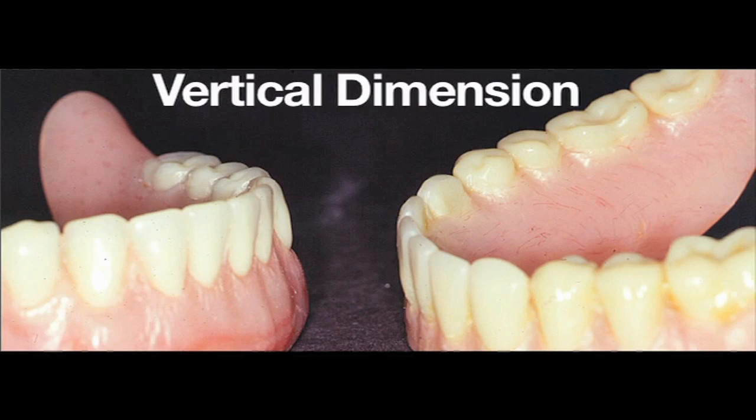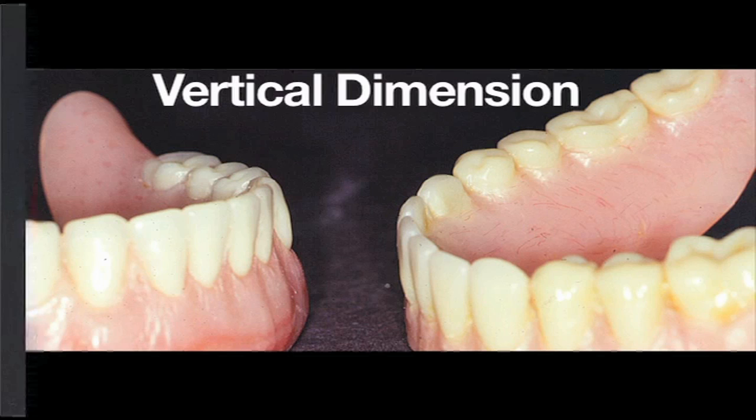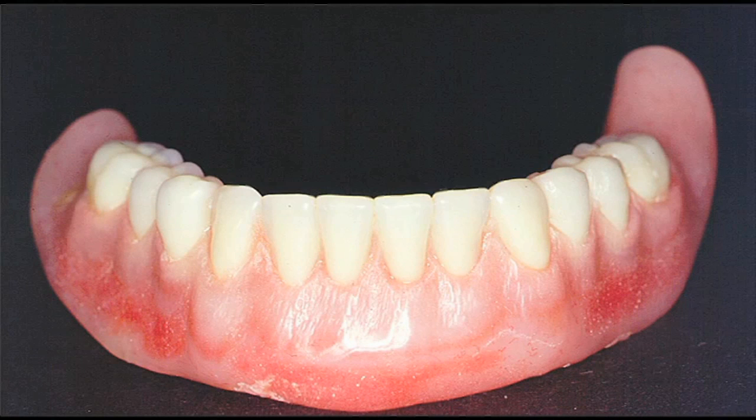Wow, vertical dimensions. So we're finally getting to the point of where the vertical dimension is and how do we find it. If we look at these two dentures side by side, you can literally see there's about 10 to 15 millimeters more on the left denture, which is our final denture, versus the denture on the right-hand side, which is the denture that she came in with. With that denture, we have done some custom modification, and you can see the amount of soft and hard tissue being replaced with our denture acrylic to give us that increased vertical dimension.